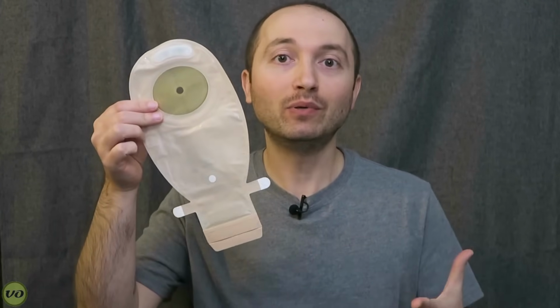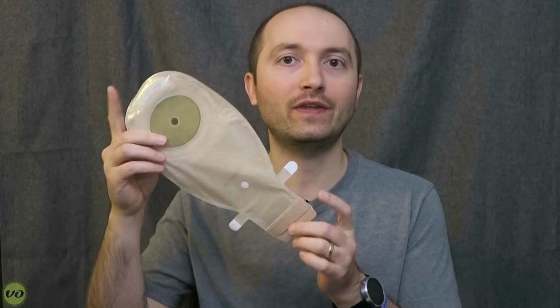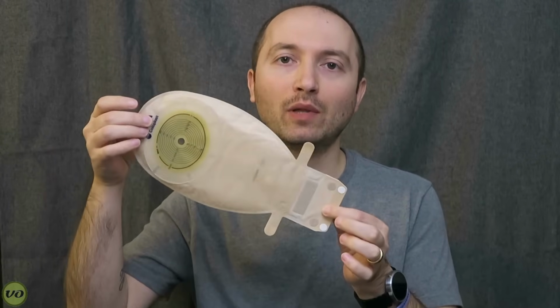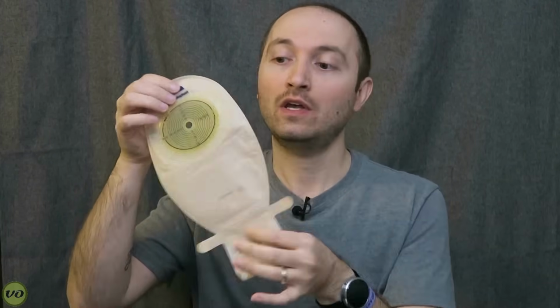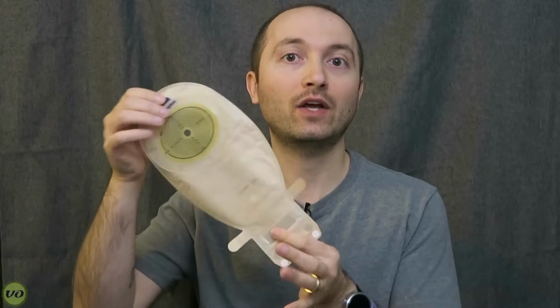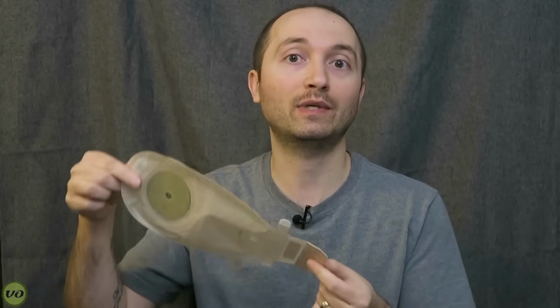I'm going to start with the one-piece system because this is the most simple system for an ostomy supply, and some people may be more familiar with this over the two-piece. When we're talking about a one-piece appliance, what we're referring to is that the wafer and the actual bag are fused together to form one piece. So there's no extra supplies needed. This is basically all you have to carry around with you if you need to do a basic ostomy appliance change.